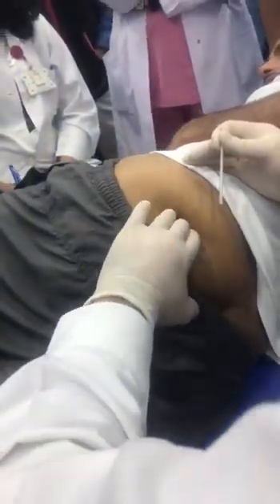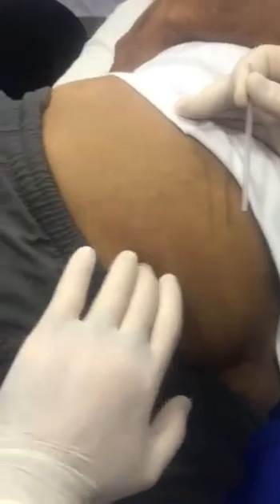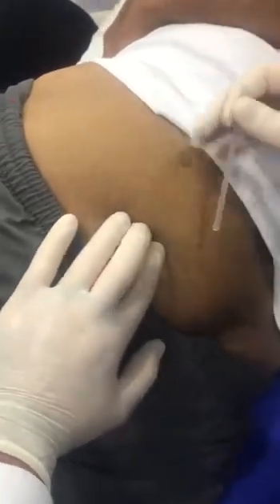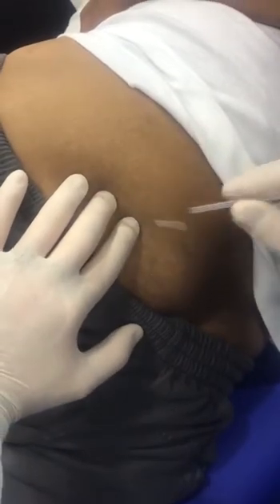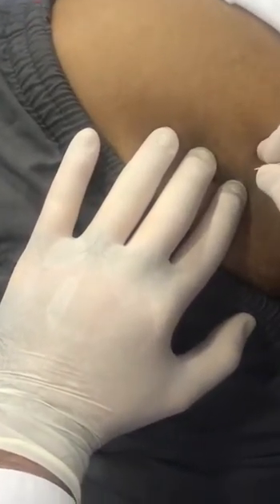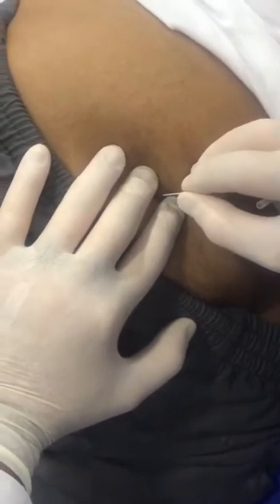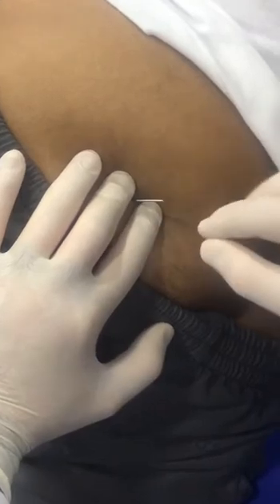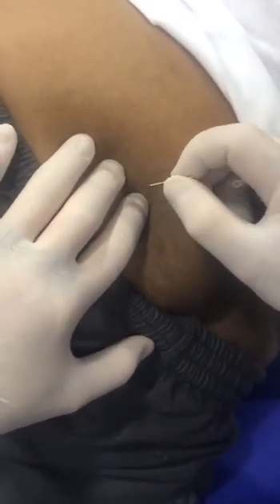So we are going to look for here I have the sulcus, so I go a bit lower. What about this area? I think it's a bit harder. It's impossible to differentiate anything, but I feel a bit harder, so I'm going to do it here. 1, 2, 3. More or less I'm going to keep this orientation. I feel some resistance. Twitch. Less resistance. Now a bit more resistance there. But here, for example, feel it. Yeah, I feel it. There is a bony feeling at the end. So with 5 centimeters I have reached everything.